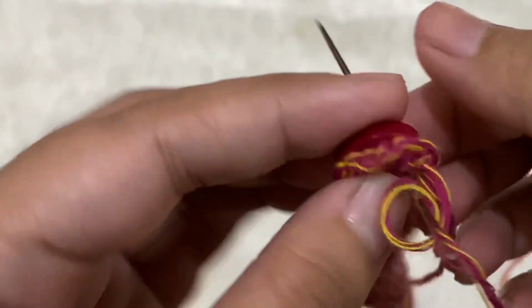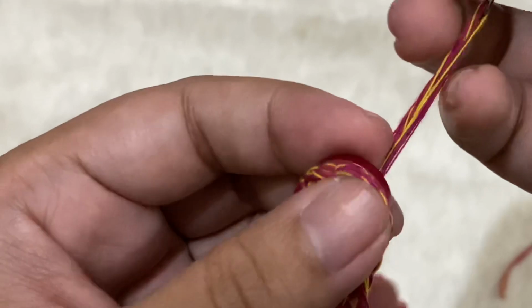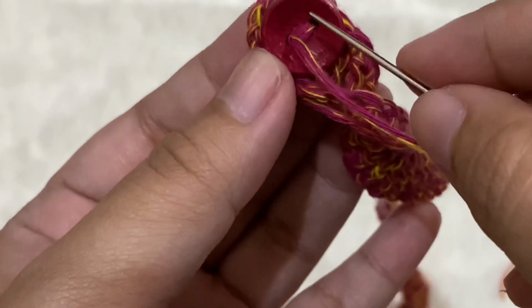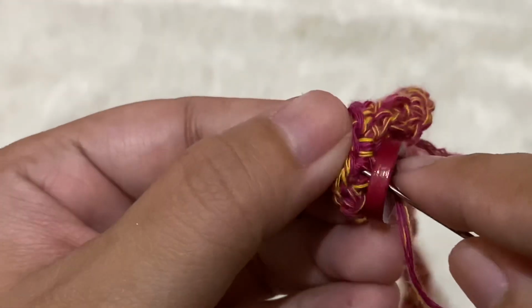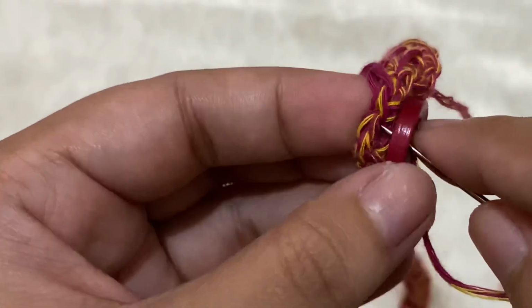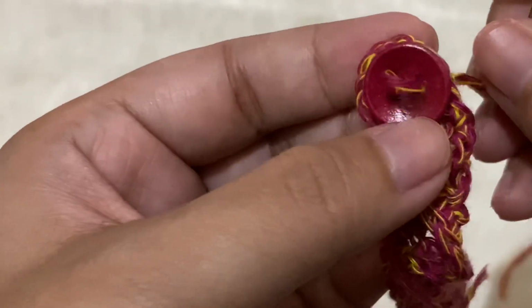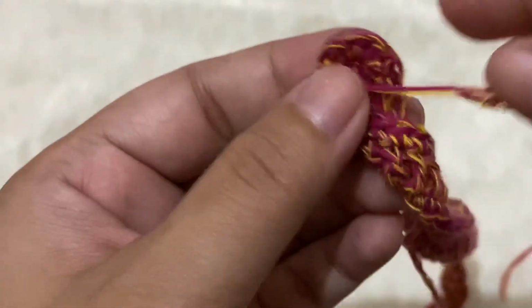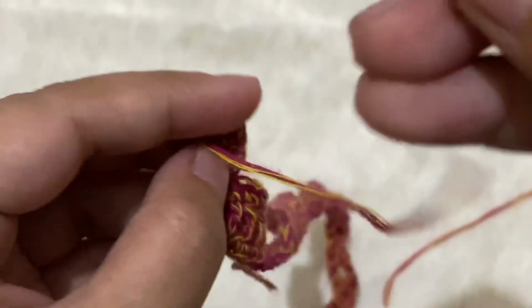So that's actually the third one, and this time it's actually a little bit tight already. I'm having a hard time pulling the needle through that hole. Again, you don't really have to do this the same way that I did. If you want to insert that yarn less than 3 times through the button, that's okay. If you want to do it more than 3 times, that's fine too, as long as you're sure that it's tight and secure like that. Okay, so I'm ready to fasten off these tails.